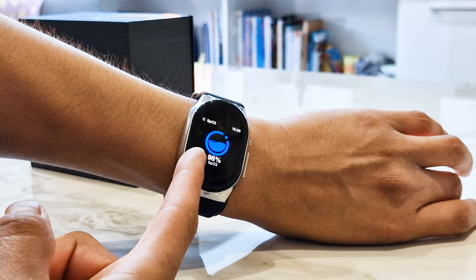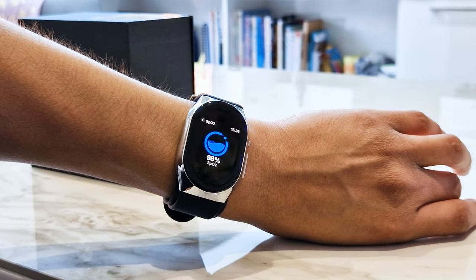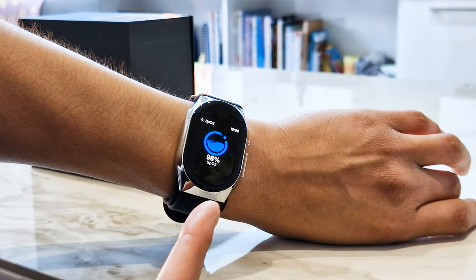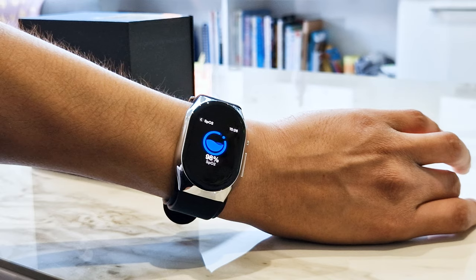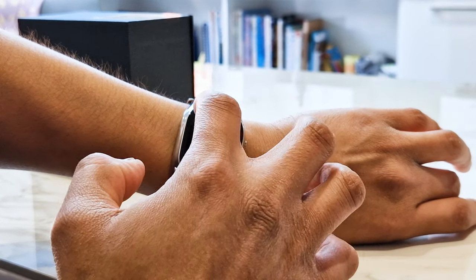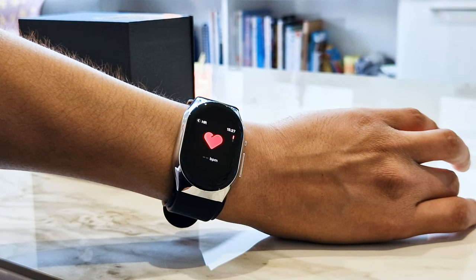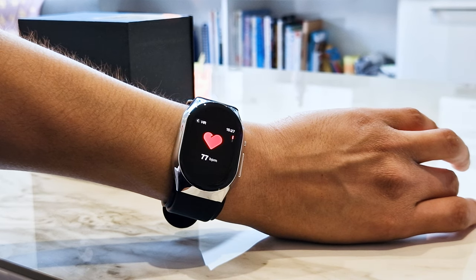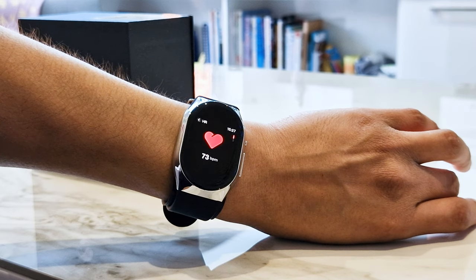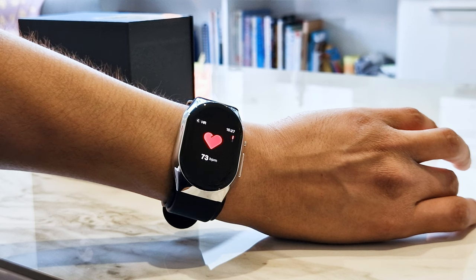You can also do an SPO2 reading — just keep still and it does the reading for you. I got 98%. Heart rate monitor works the same way — keep still and it gives you a reading. I'm getting 77 BPM.